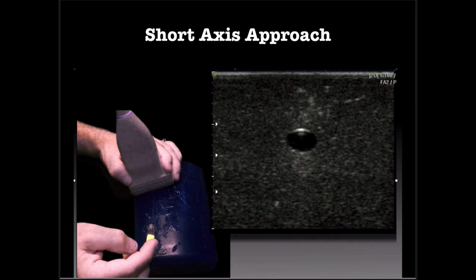So Becky wanted me to remind you, you want to redirect. Now, when I'm doing vascular access, I don't think of the transducer as right and left. I think of it as right or wrong. So if I'm looking at my needle and I move my needle and it goes the wrong way, I move it the opposite way. So it's right, wrong, and not right, left.